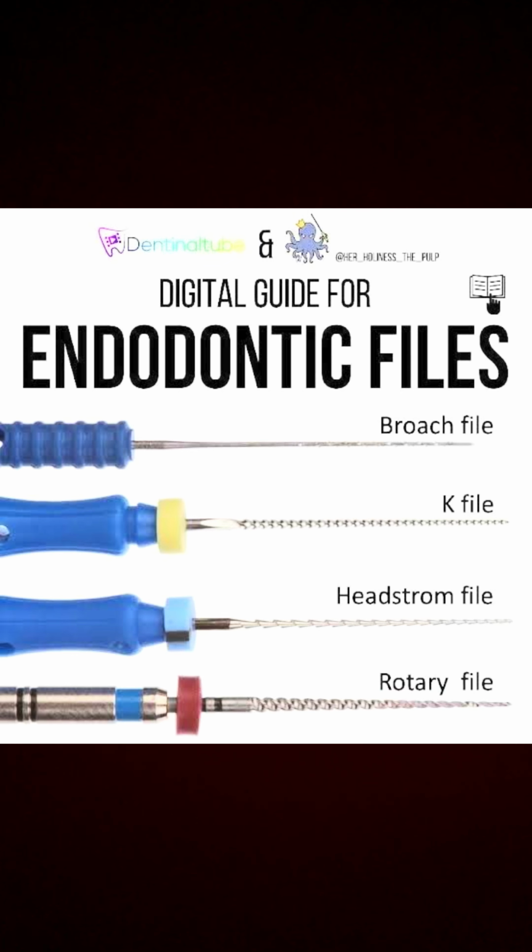The introduction of the nickel titanium alloy for manufacturing endodontic instruments has improved canal shaping due to its improved flexibility compared to stainless steel.